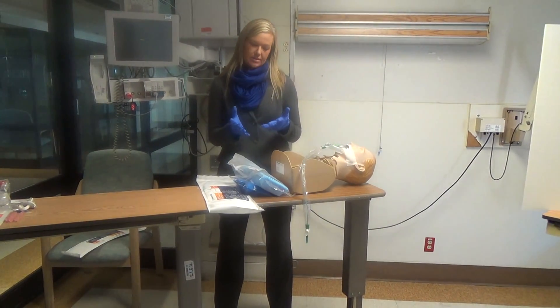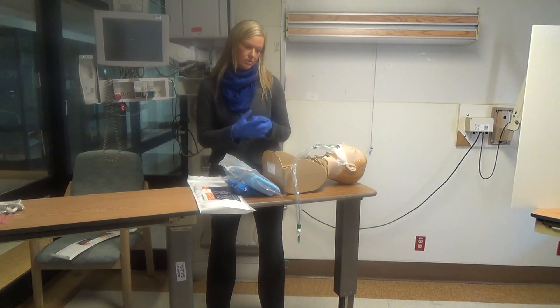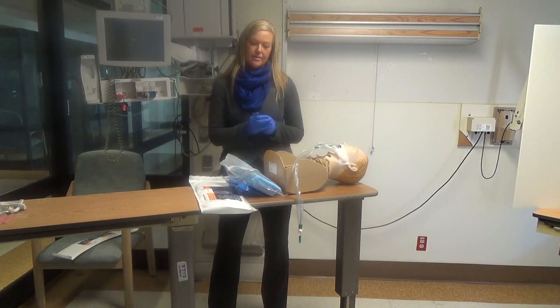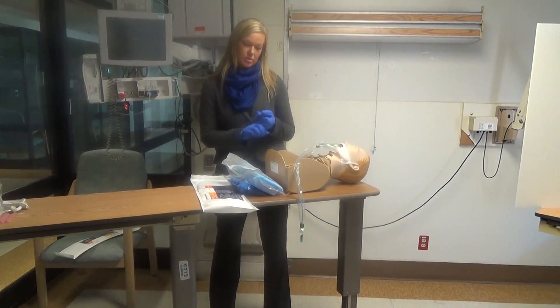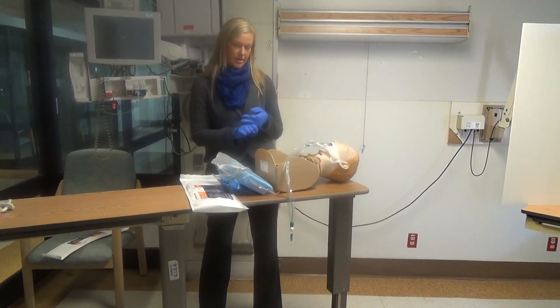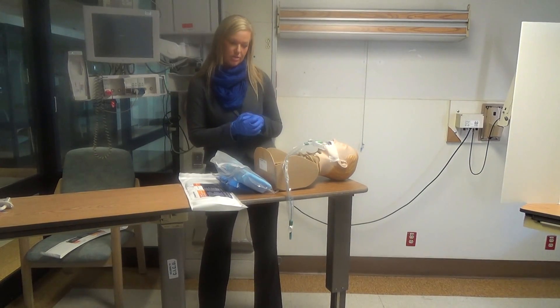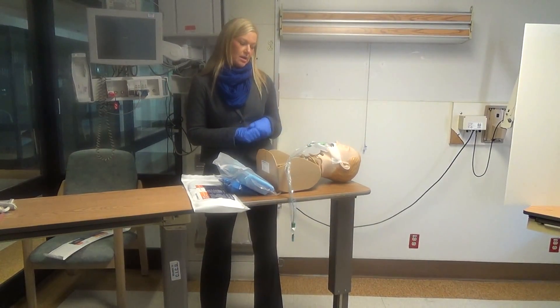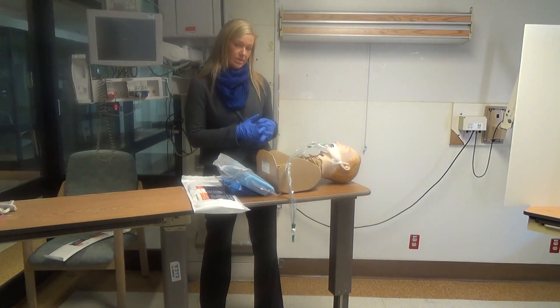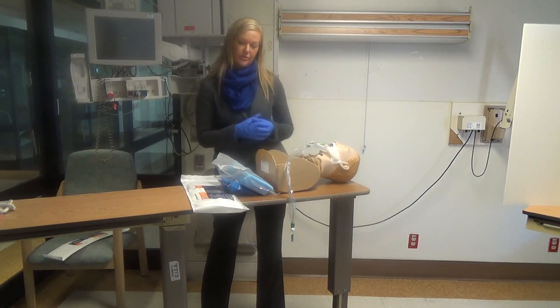Farid talked about the importance of having two RTs at the bedside. If you have orders for this procedure, please call another RT to assist you at the bedside. Once you've double-checked all contraindications, confirmed with the nurse, and turned off all feedings 45 minutes to an hour prior to the procedure, and the patient is on 100% oxygen, go ahead and get set up for the procedure.